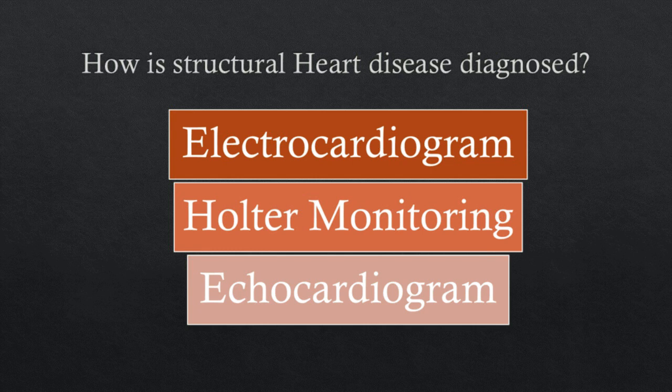An ECG records the electrical signals and can help your doctor detect irregularities in your heart's rhythm and structure. You may have an ECG while you're at rest, or you may have a stress electrocardiogram. An ECG would be performed while you exercise. Holter monitoring is another type of testing. A Holter monitor is a portable device you wear and can record a continuous ECG. You usually have it on for 24 to 72 hours. Holter monitoring is used to detect heart rhythm irregularities that aren't found during a regular ECG exam.